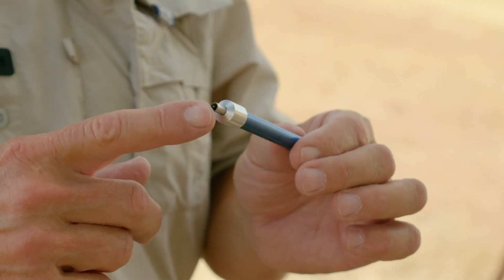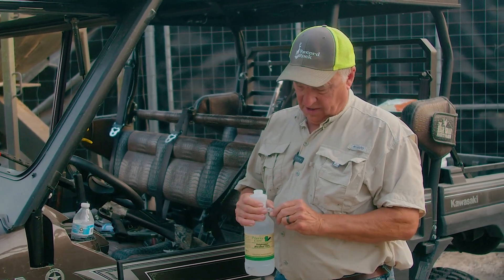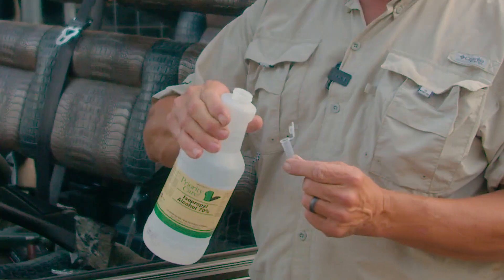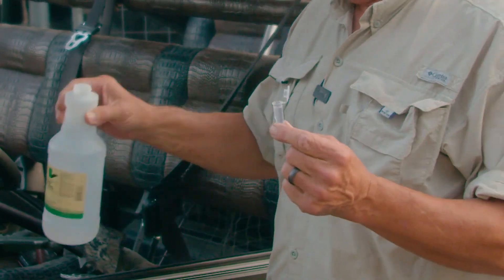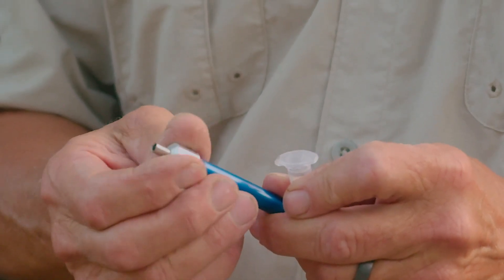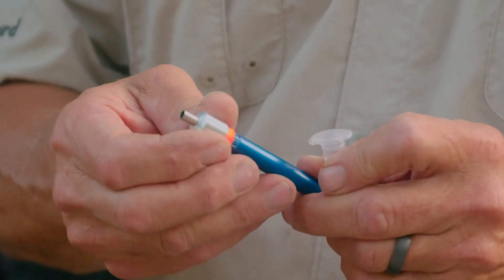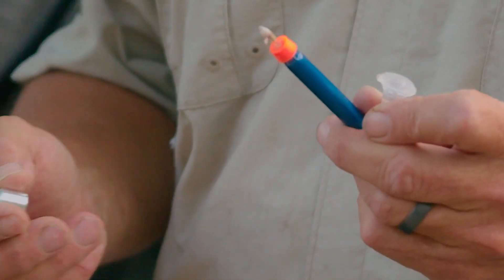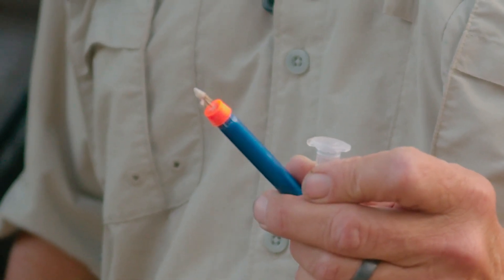Before we show you that sample, I want to tell you something about these darts — these are not to be reused. The reason why is because of possible cross-contamination between samples, and also you do not want to compromise the cutter on the front of the dart. So we're going to take the little vial right here, open it up, put some alcohol in there, and that will preserve our sample. Take a good close look, because this is pretty cool — we're going to unscrew this right here, which will unveil the needle and the small sample on it. That little sample of deer hide right there is what we can get the DNA off of.